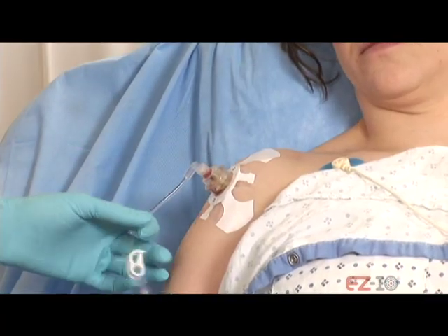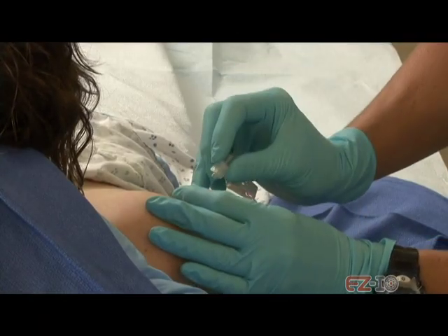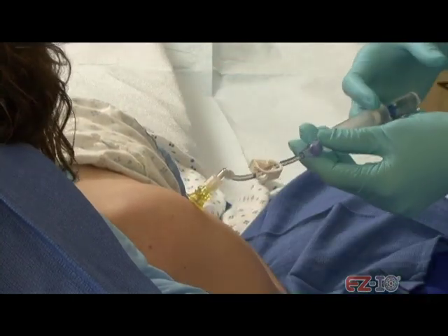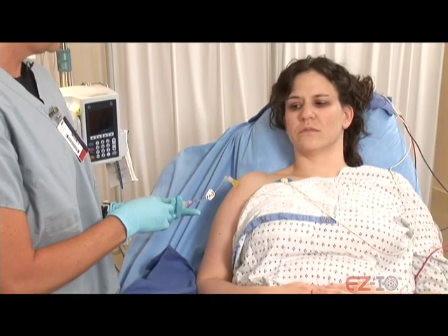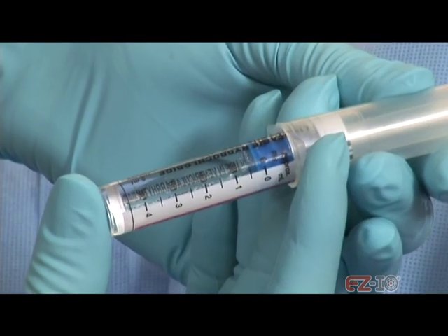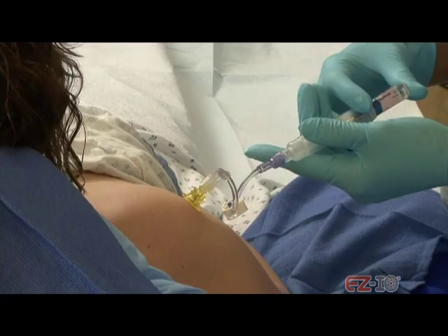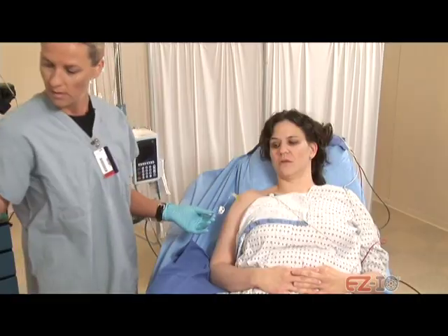Prepare the site according to your protocol. Attach the Easy Connect to the catheter hub. If the patient is alert or responsive to pain, consider administering 2% lidocaine without preservatives or epinephrine, also known as cardiac lidocaine, following your institutional policies and procedures. A physician or other authorized prescriber must determine the appropriate dosage range.